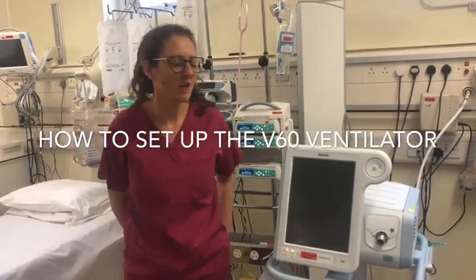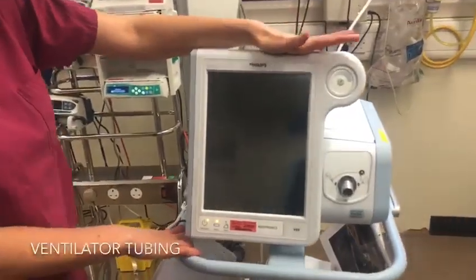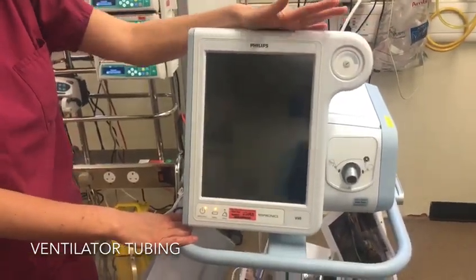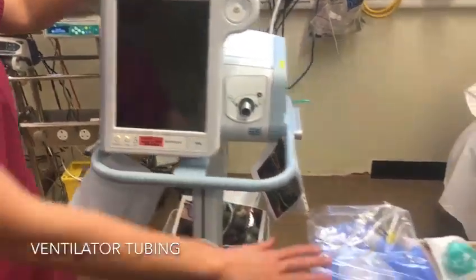This is a quick video of how to set up the V60 and start it. So this is our V60. We have a few in the trust, normally used for BiPAP, but at the moment we're going to be using it for intubated patients. To set up your V60, you need some tubing.